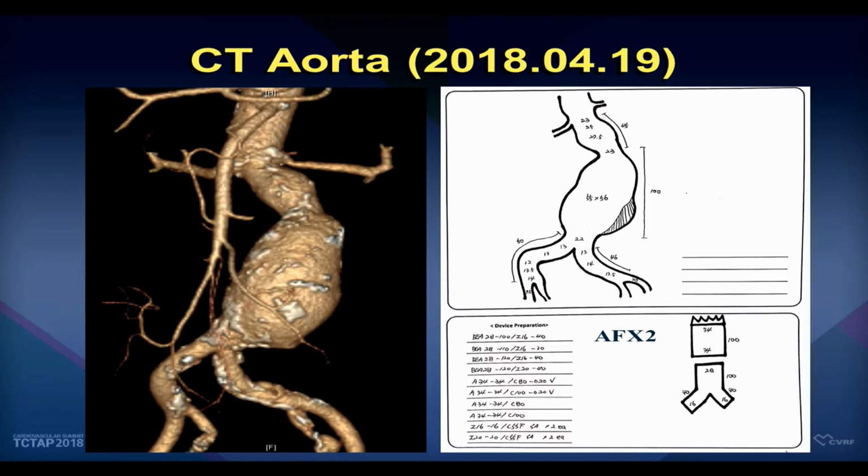But until now, we have only had the proximal extension endograft for the proximal part. But today we can use the Vela proximal endograft. So we'd like to demonstrate this device for the audience.